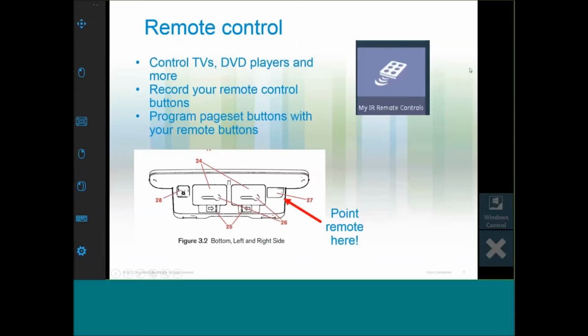Many communication devices have built-in remote control capabilities. I couldn't find any good instructions for how to set this up in the Toby documentation. I found something on the Toby website. The thing you have to understand is that the device doesn't know how to control your TV and DVD player. You have to teach the device how to control your stuff.